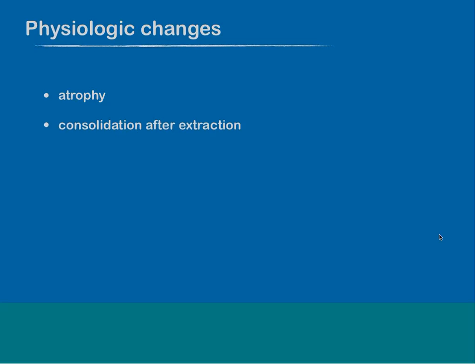After extraction of teeth, you can check out for the consolidation of the alveoles. You all know that the bone needs some time to consolidate, and that, let's say after 4 weeks to 6 weeks, you see first results of consolidation, and that's what we right now will look at in the next few minutes.